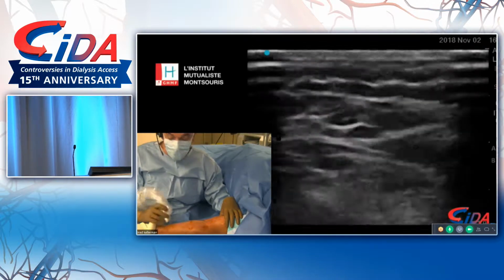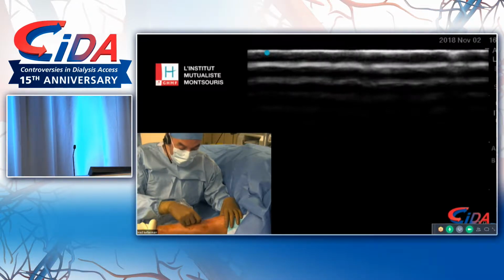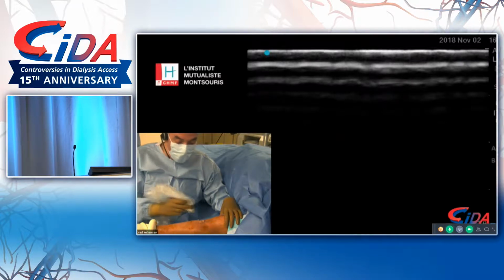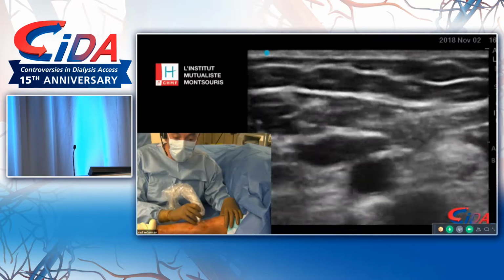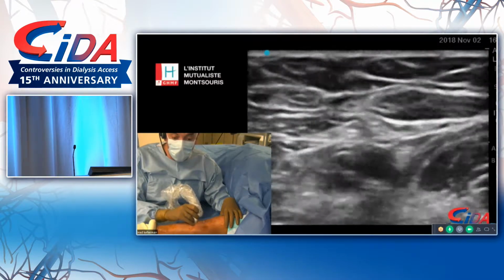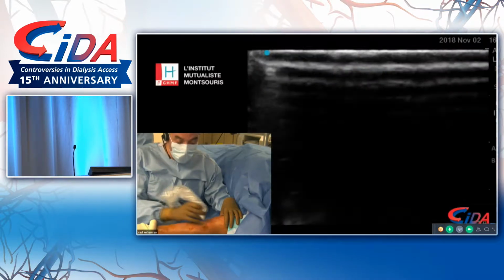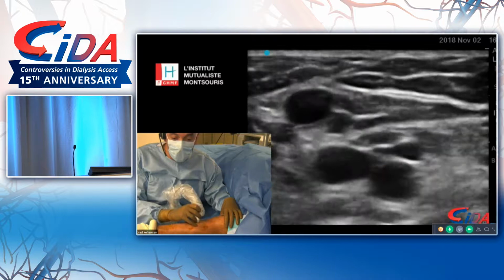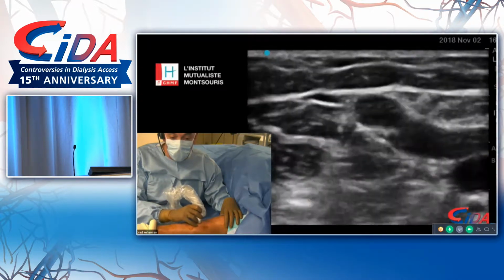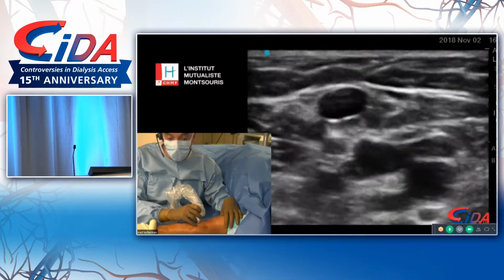So for these patients, as my mentor, Dr. Jennings, taught me when I was in my fellowship in Tulsa, I started doing proximal radial artery fistulas. You're still in the radial, and see how beautiful and normal this artery looks here in the proximal part, while in the more distal part it's calcified. In this way, you have a larger vein, a better artery, and the vessels are also very close. The perforator and the radial artery are just side by side, so you can do a surgical anastomosis.